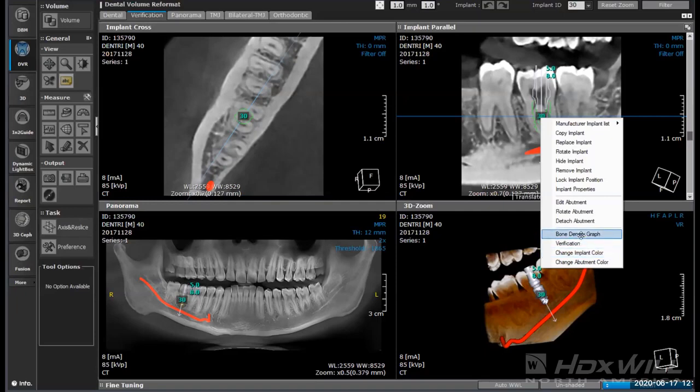And this is where it gets kind of fun, because in the past, when you put in an implant, a lot of it had to do with the tactile feel. You could take a 2D image and assess kind of the quality of the bone, but until you actually got in there and drilled the bone and started putting in an implant, were you more sure about your treatment plan, how good that bone was, and how quickly you could load bear that bone.